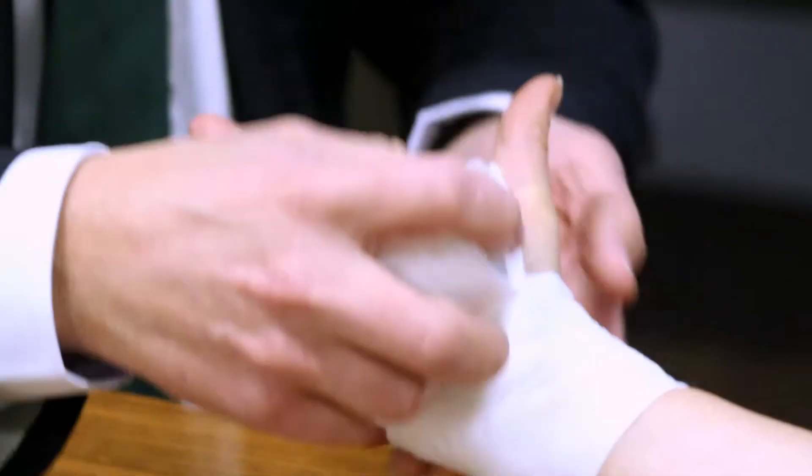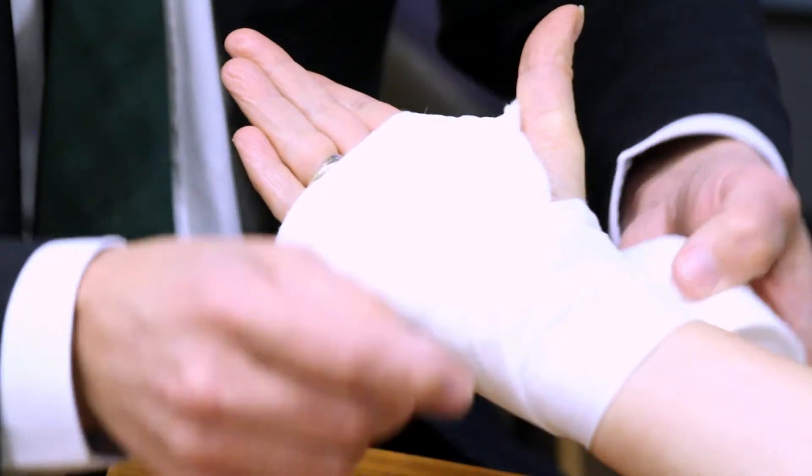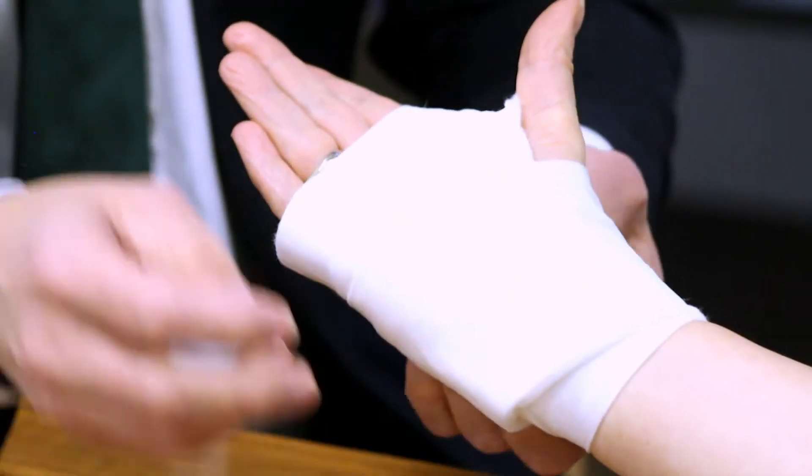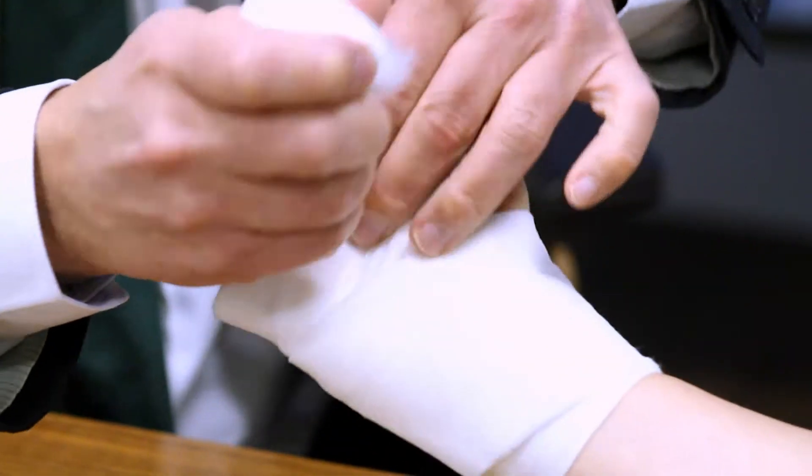And we wrap this usually around the wrist for carpal tunnel surgery, and around the thumb like that, leaving the thumb free. And we usually try to leave these joints free as well. So we'll tear this off like that.